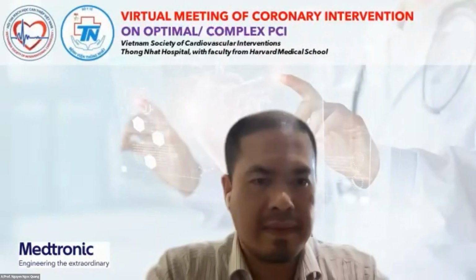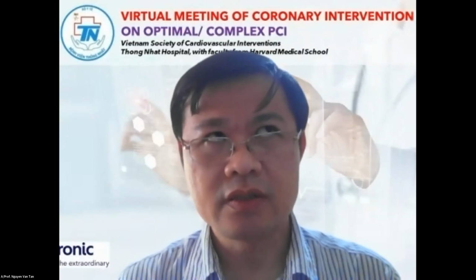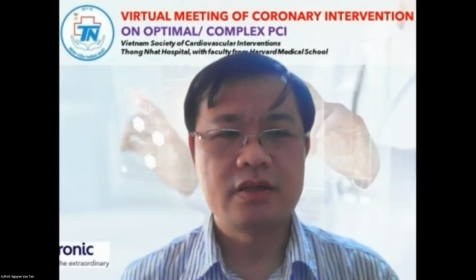Yes, thank you for your comment, Professor Nguyễn Ngọc Quang. If we have OCT or IVUS, we can use it in complex PCI. However, in Vietnam now, IVUS is covered by insurance, but OCT is not paid by insurance, which is a problem, because OCT is helpful for complex PCI, but the price of OCT now is expensive. So I hope in the future insurance will cover OCT for our patients.